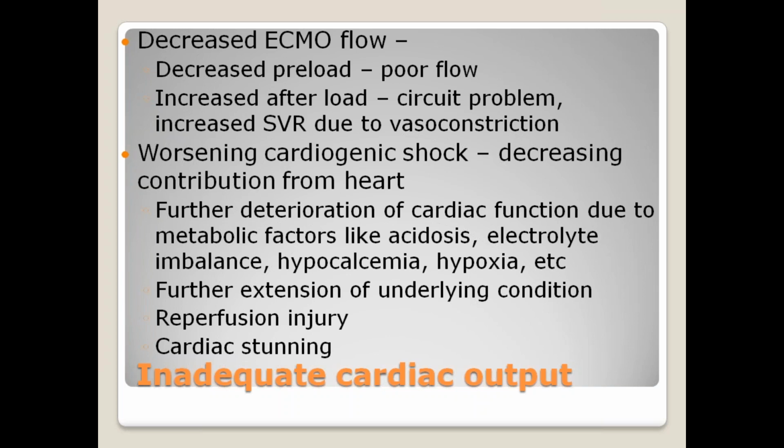Patient improved. But then again you found that patient is going down. The reason is the cardiac contribution which was there has gone down. So what you need to do is, because the cardiac contribution has gone down, you cannot correct that. So you can go up on the flow and try to maintain the good cardiac output. That is what is most important.